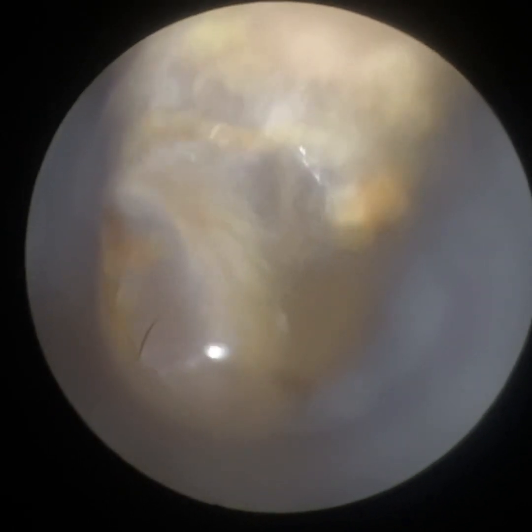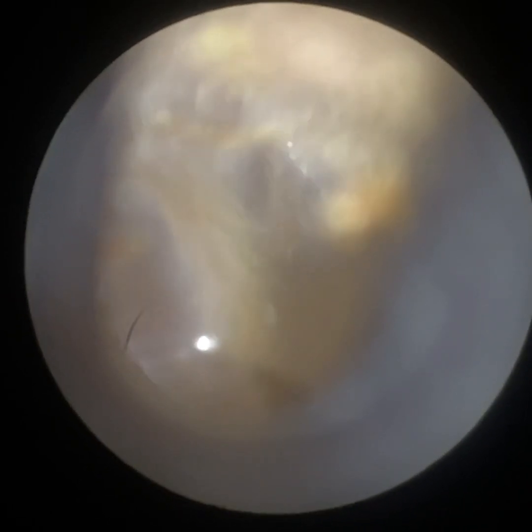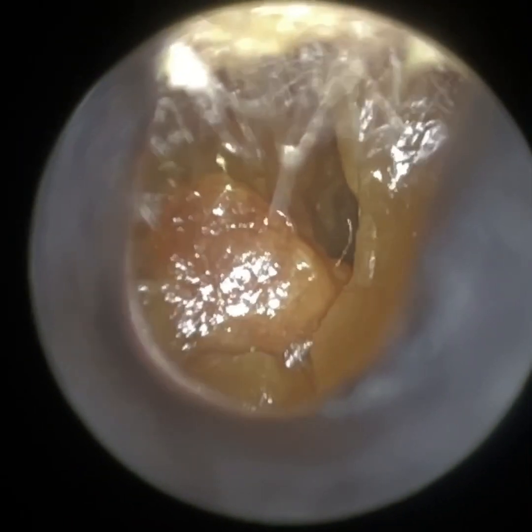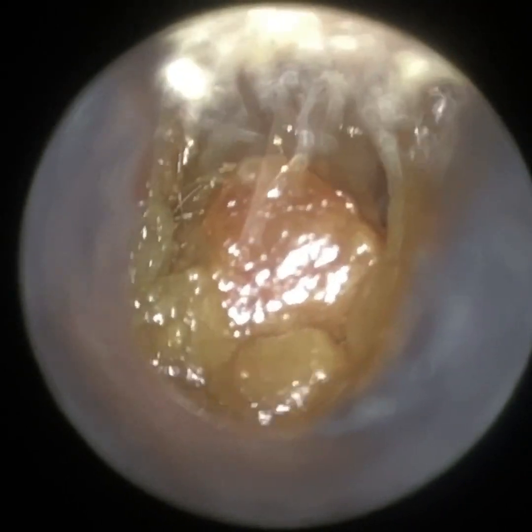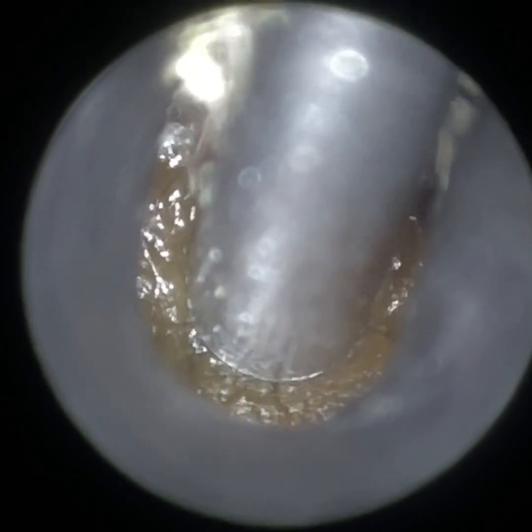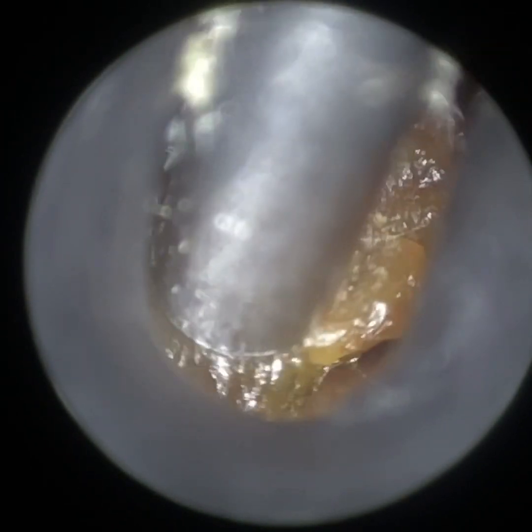I've just attached the 3.5 millimetre speculum, the smaller one, just so we can actually get into the ear because it's so narrow and bendy. You can see the eardrum there. The audiologist, as I said, is a colleague — they were quite impressed by it. They've been watching the videos for years and are fully aware of the iClearScope, but they understand the concept of the Waxscope.